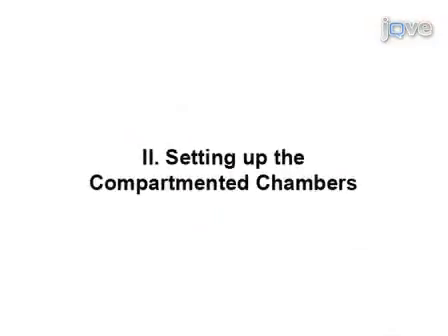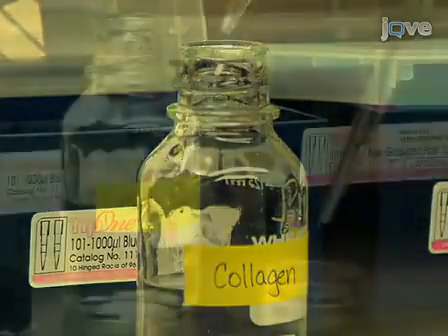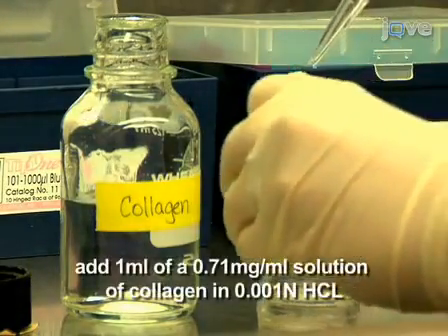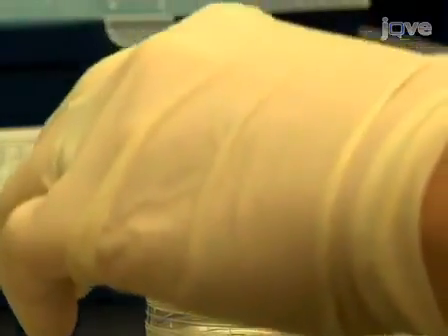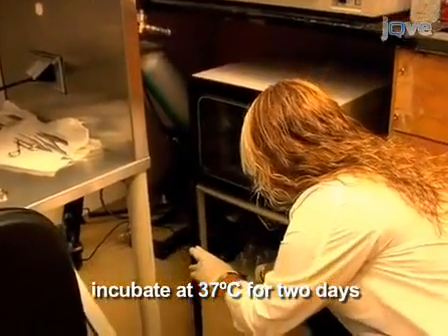So let's get started. Before setting up the compartmented chambers, P35 tissue culture plates must be coated with collagen. To do this, add one milliliter of a 0.71 milligram per milliliter solution of collagen in 0.001 normal HCl to the plates and incubate them at 37 degrees Celsius for two days.